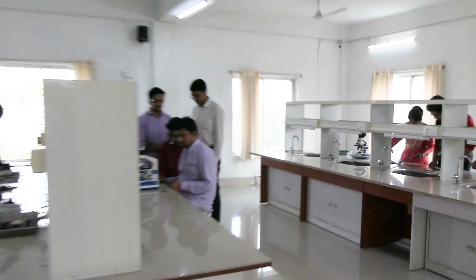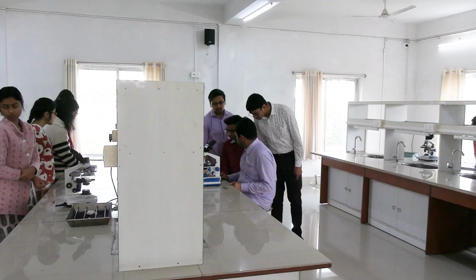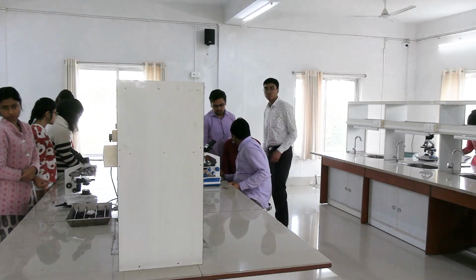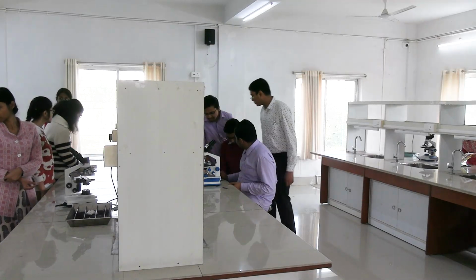I thought I will mention it in the class. Never write as plus or minus. That is a common practice. Minus may be easily tampered. Just by giving another vertical stroke, it may be converted to plus.